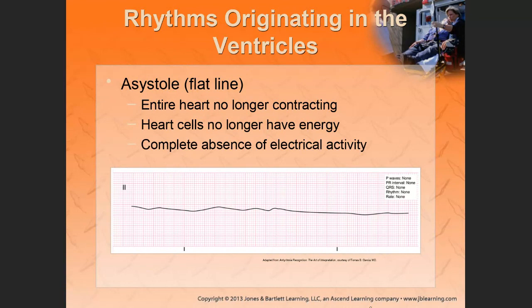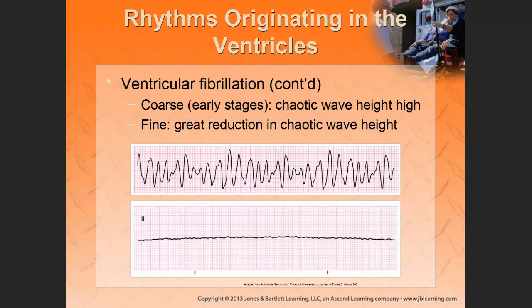So these are your rhythms that you need to be familiar with. Normal sinus rhythm, sinus bradycardia, sinus tachycardia, ventricular tachycardia, ventricular fibrillation, asystole, and there is one last one. So one more.